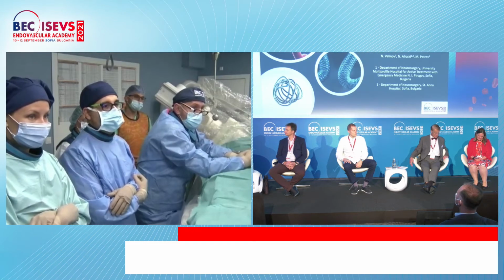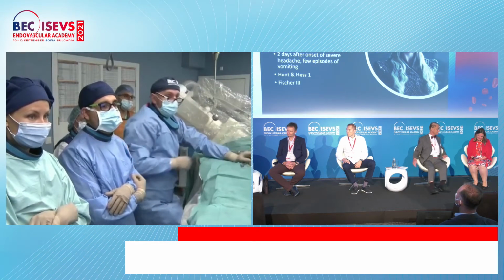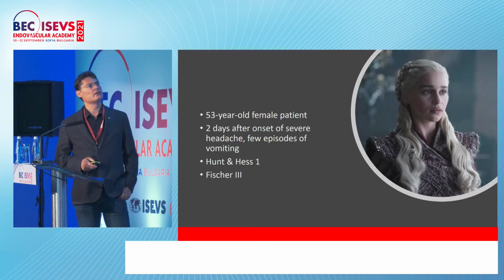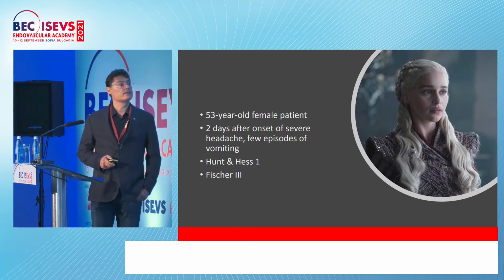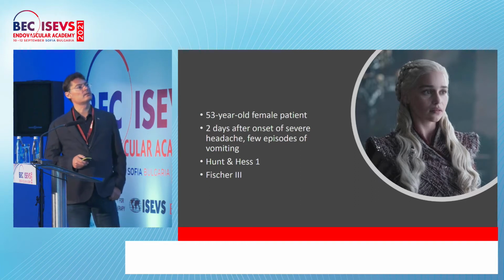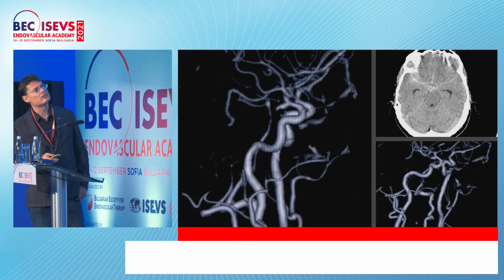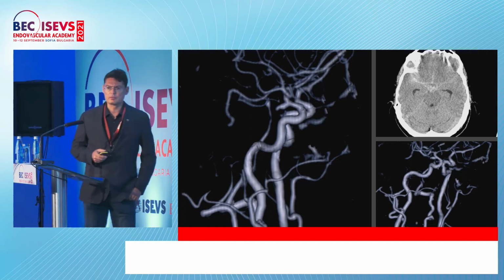Next case is a 53 years old female patient, 2 days after onset of severe headache, of vomiting, Hunt and Hess 1st degree, Fisher 3rd degree. Aneurysm, subarachnoid hemorrhage.